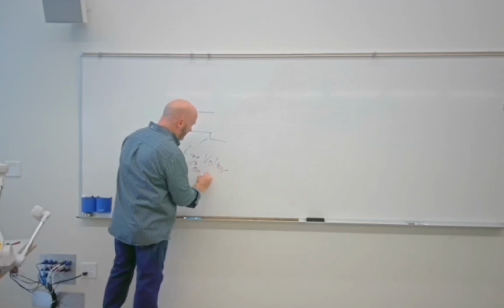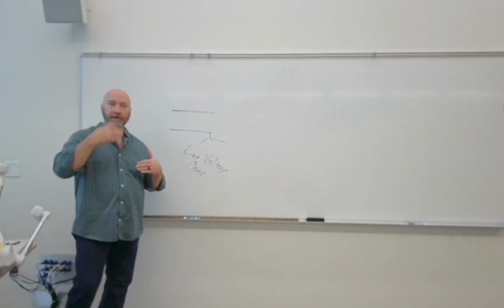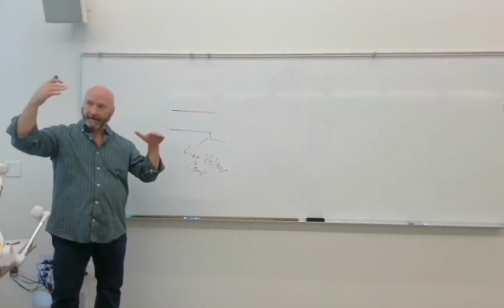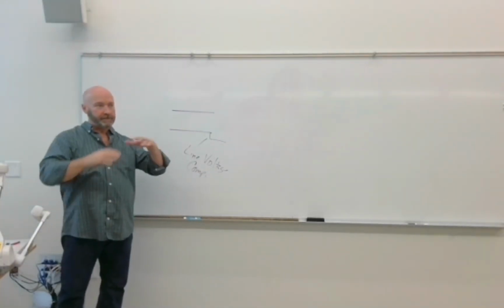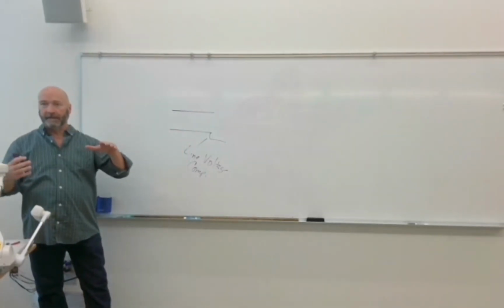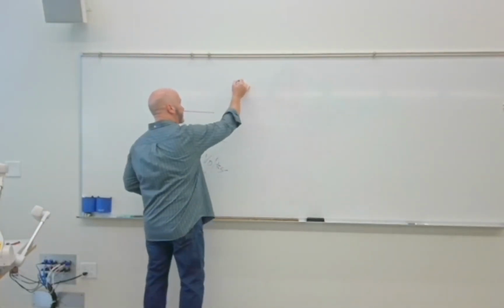Okay, so the line voltage compensator compensates for fluctuations in incoming line voltage. If you have a power surge, it keeps it steady. If you have a power dip because the air conditioner kicks on, it still keeps it steady. All right. Now it goes directly into the autotransformer.